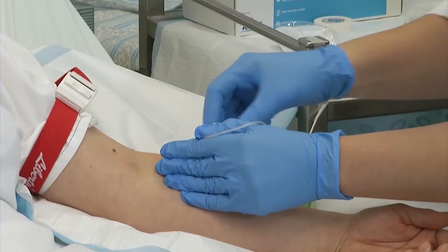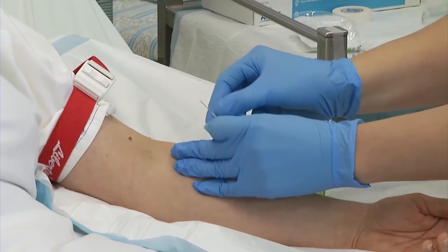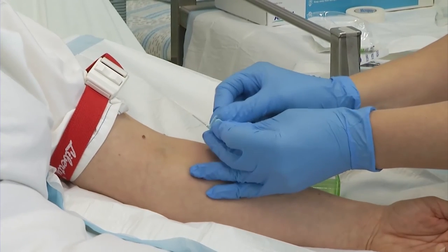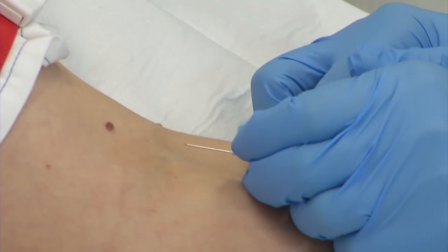Venipuncture is collecting blood from a vein for diagnostic purposes or to monitor a patient's response to treatment. Accessing the venous system is an invasive procedure and requires a patient's consent.